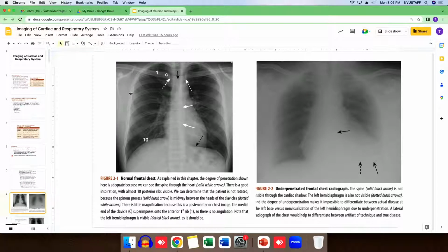As you see here, you are seeing some white stuff. This white is all calcium material. And air is inside the lung, and you can't see it, it's just black. Also, you see bronchi here, these structures that are located. They are also structures, and as it is a tube with air inside, that's why we're having this kind of appearance.